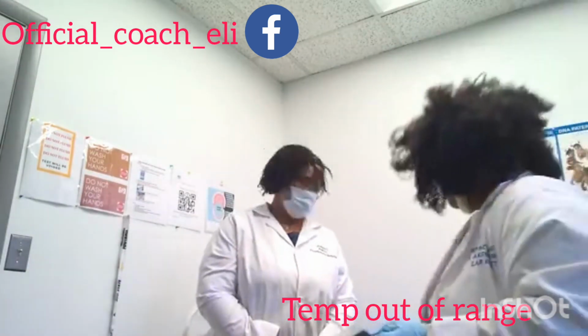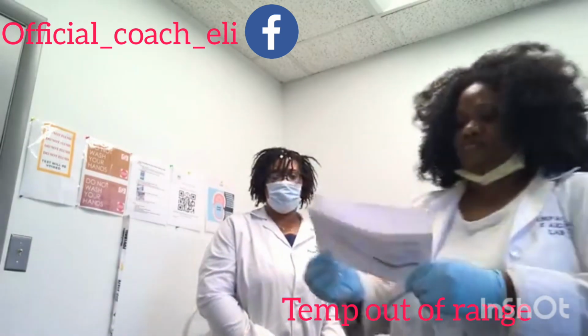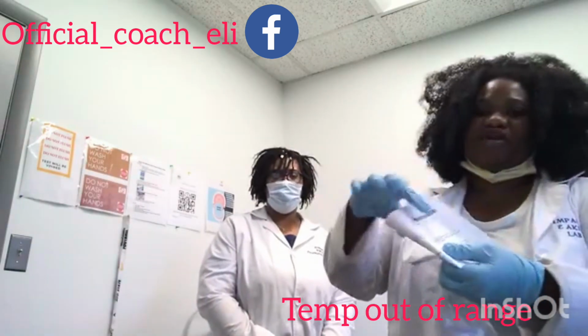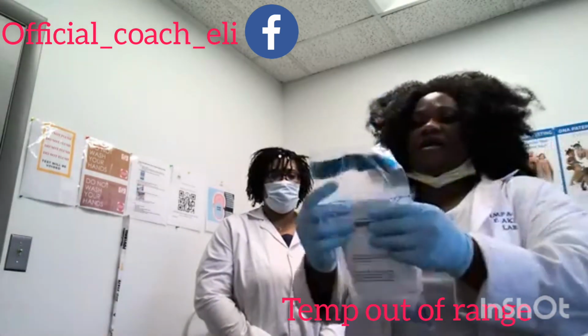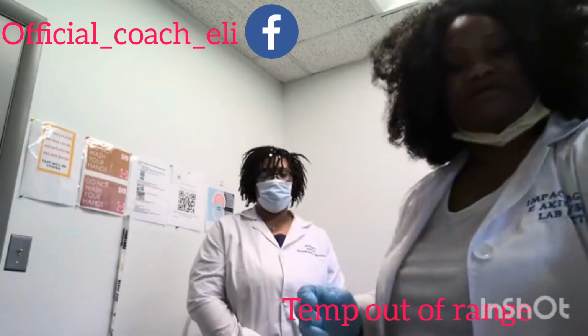it up. All right, I'm going to fold it up and put it behind, making sure this barcode faces the back. Faces like that. And I'm going to seal this, and this is 1 of 2. All right, that's done. I'm going to set it right there.